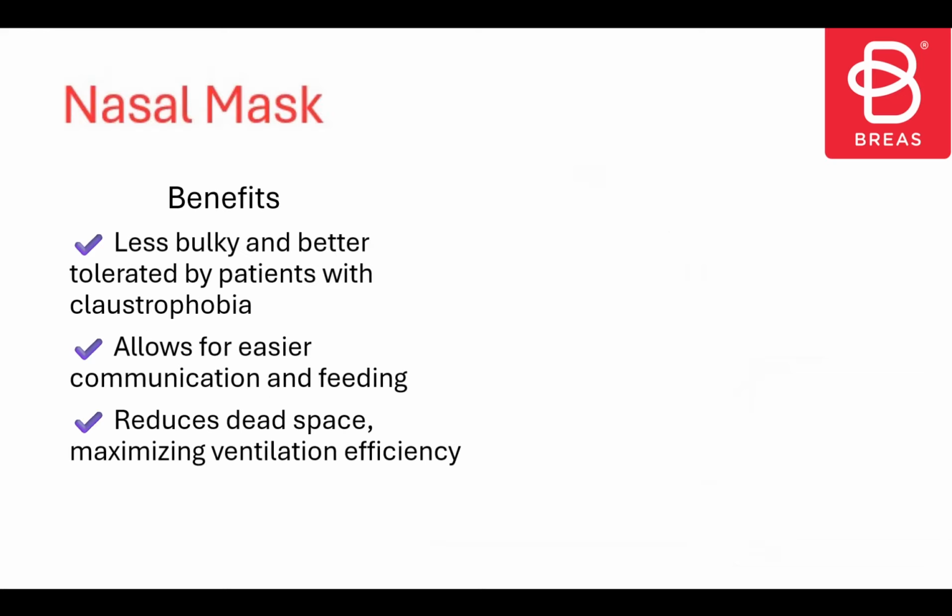Let's start with nasal masks. What are the benefits of having a nasal mask? First of all, it is less bulky, is better tolerated by patients, especially patients who have claustrophobia. It also allows communication, since it will only cover the nose, and therefore the patient will be able to communicate and he will be able to eat too. And it decreases dead space, which can optimize ventilation.